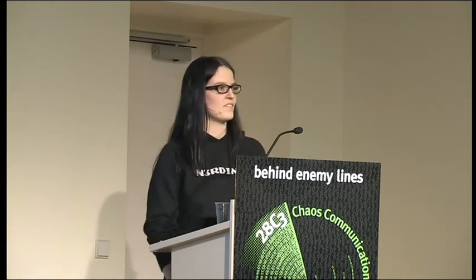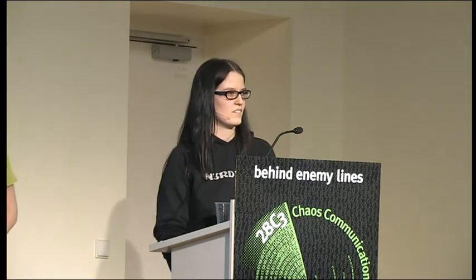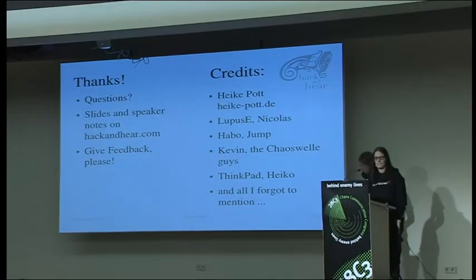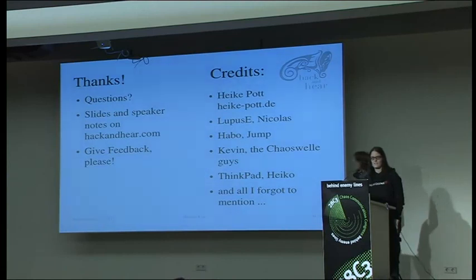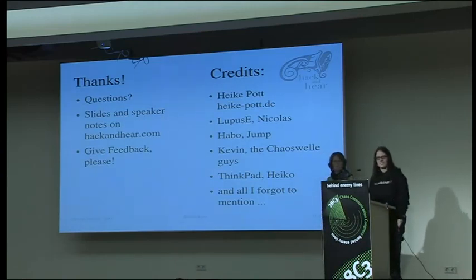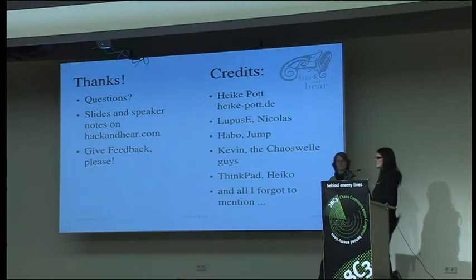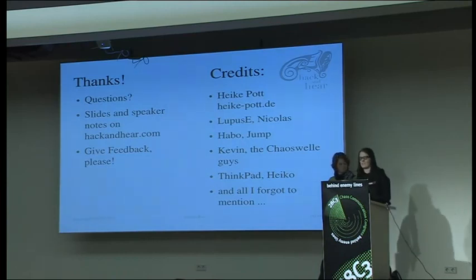Okay, hi. You showed us the programming tool for changing the settings on the hearing aids. I've forgotten the name, but the 1980s modem. Have there been any attempts to clone that hardware or reverse engineer the spec? I'm not sure if I understood correctly. You mean how you get the hardware for this? Yeah, so at the moment you have to buy the programming tool, as I understand, to update the software. Since it's only sold to audiologists and doctors, you have to be friends with audiologists or doctors, and somehow they can give you that, but there's no official channel. So you have to find the black market.